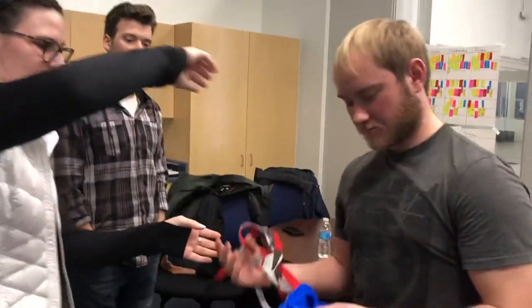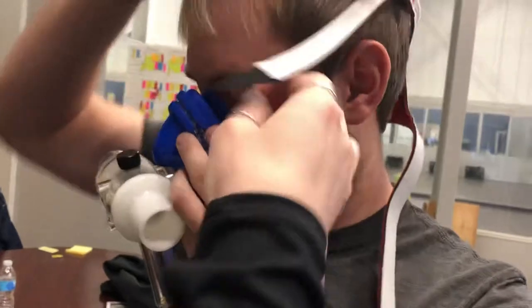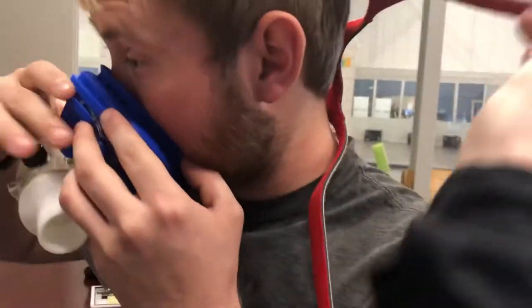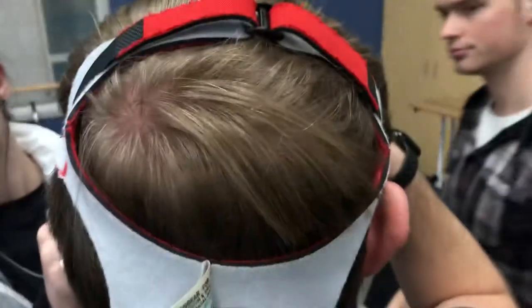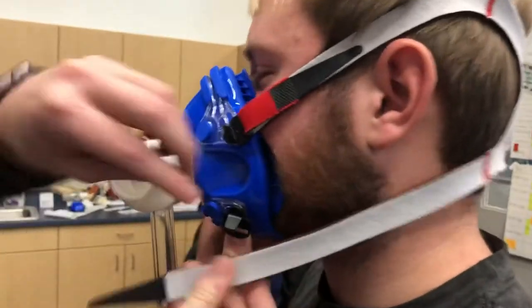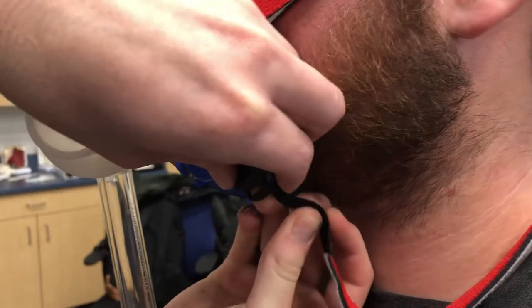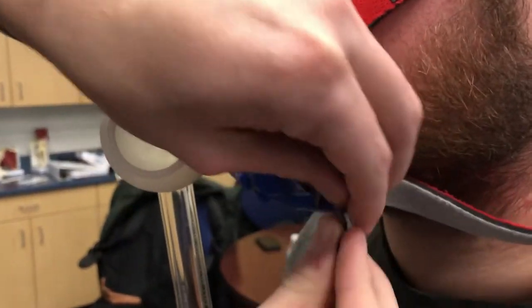We're going to put the headgear and mouthpiece on. We want to make sure we've got a really tight seal around the nose and mouth, and make sure this portion of the mask is all the way up here to stabilize it well. This piece sits right on top, and this part goes more behind the occiput. Then we run the black portion of the strap through the black button and pull it through to tighten it up.